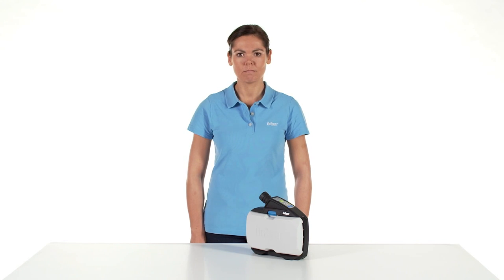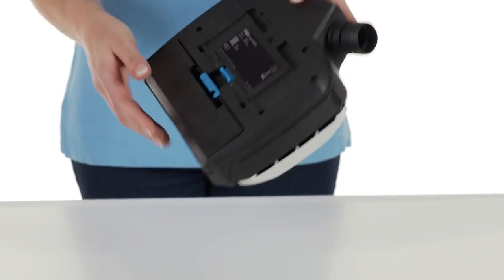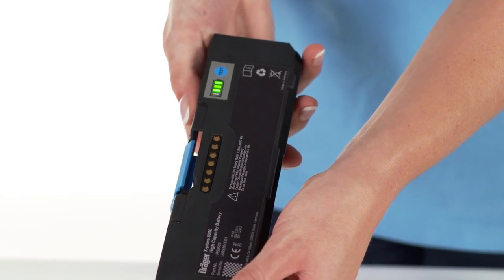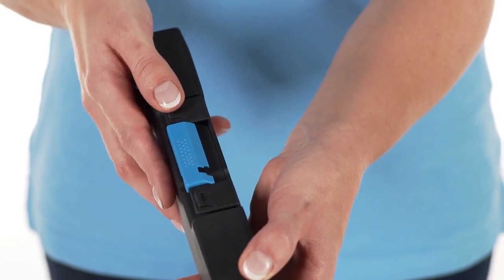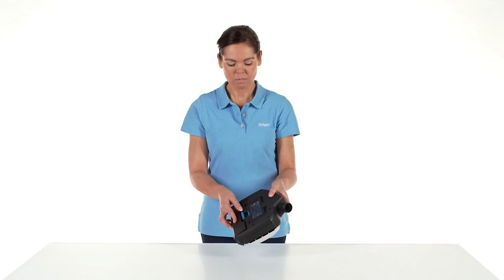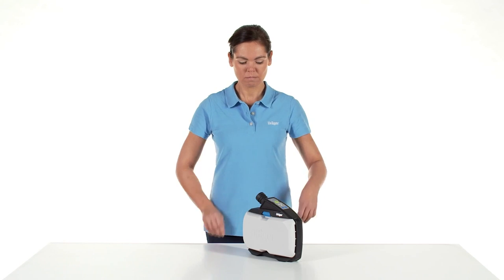To check the charging status of the rechargeable battery, remove it from the device or the charger by pressing down the blue locking button. Now press the button on the battery to show the charging status. To reinsert the battery, hold it with the blue locking button pointing upwards and the contacts pointing to the device, then insert it into the battery compartment and press until it audibly clicks into place.